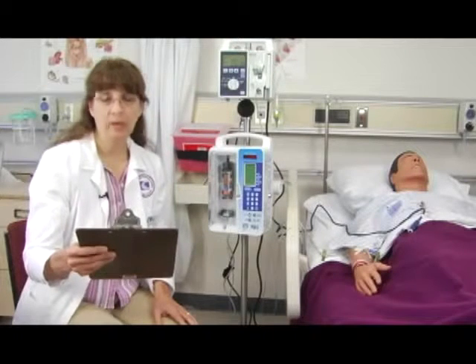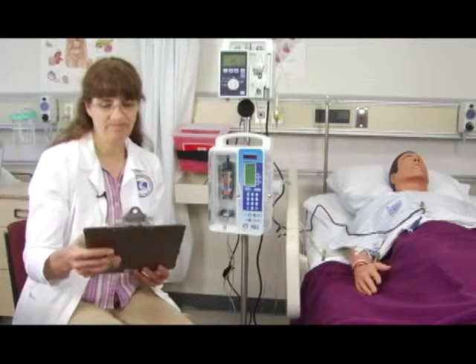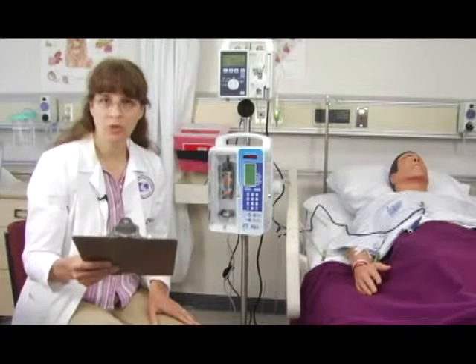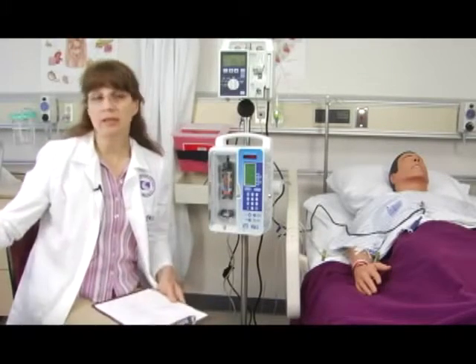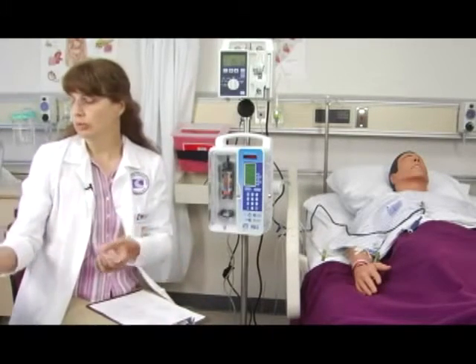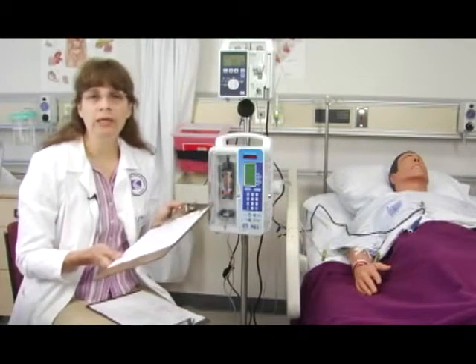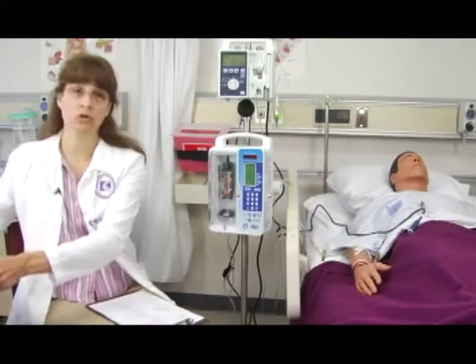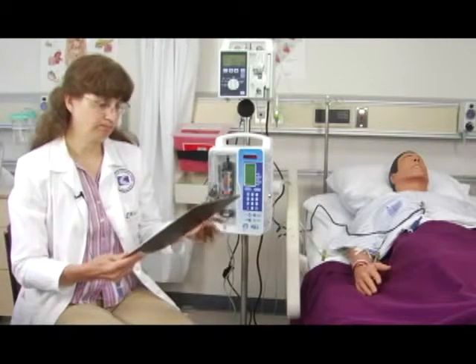First, we're going to talk about making changes to the RX, the prescribed order on the pump. Before starting, you're going to want to wash your hands and gather the equipment that you need. You will need the PCA key, and you will need the PCA record for your patient. You'll also want to get the help of a second licensed nurse because you will be making changes with the door of the pump open.